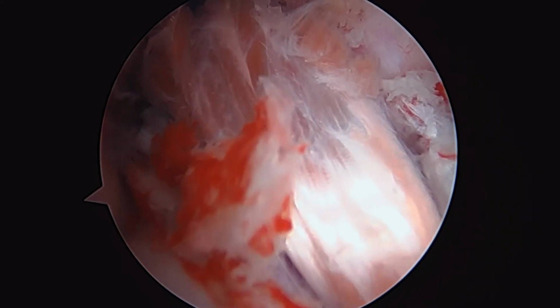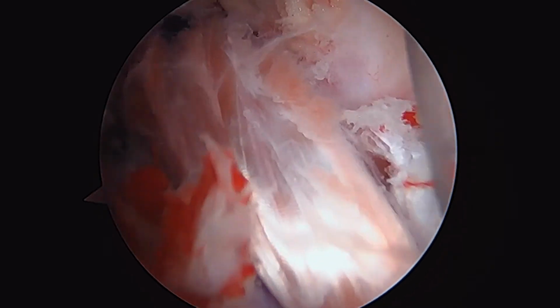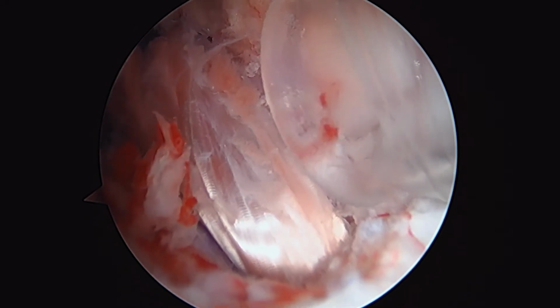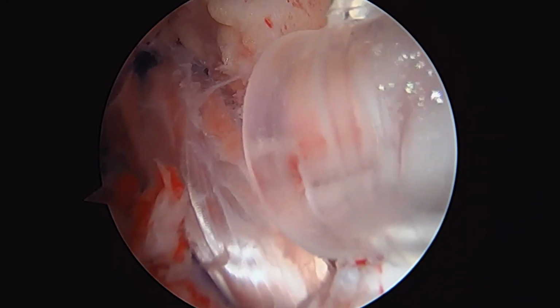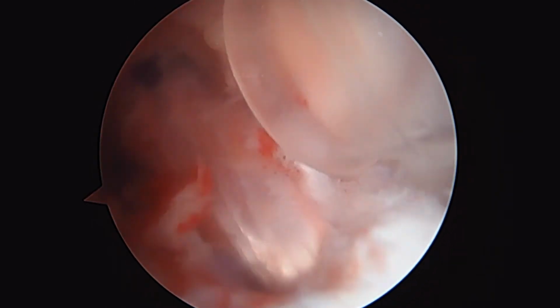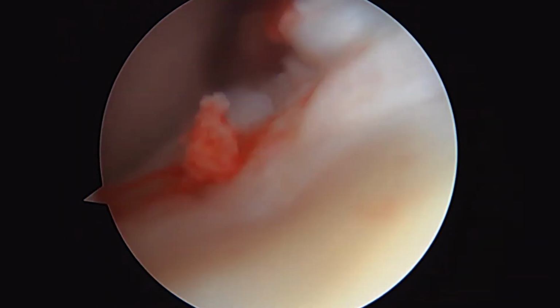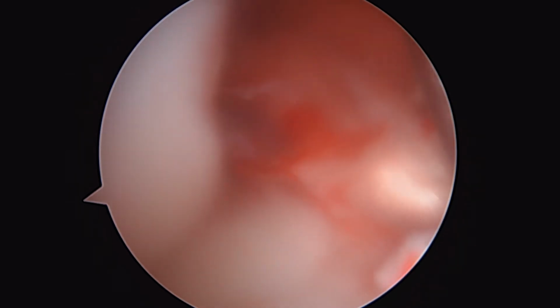And then we'll fix the graft on the tibial side with an 8 by 35, unless we have a 40. Whatever we have, 8 by the longest screw. Whatever the longest is. Okay, so we're straightening the knee all the way out. Look down for, and then we'll flex the knee up. And that graft has good tension on it. I'm happy with the way that looks.